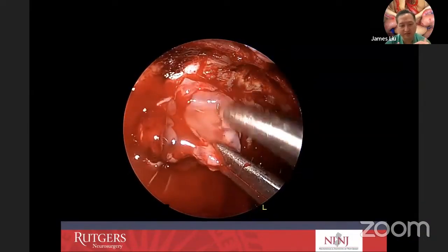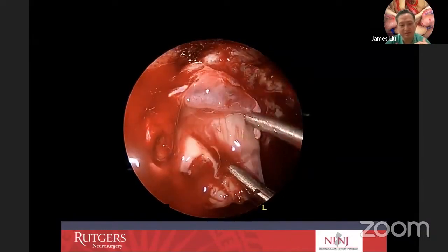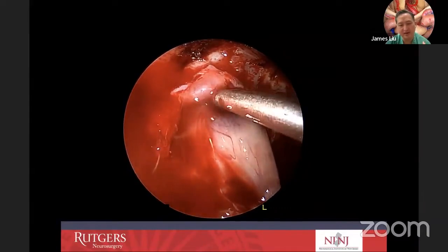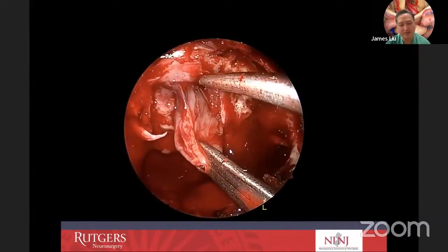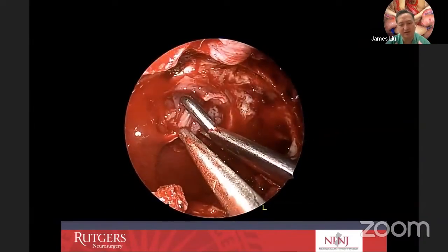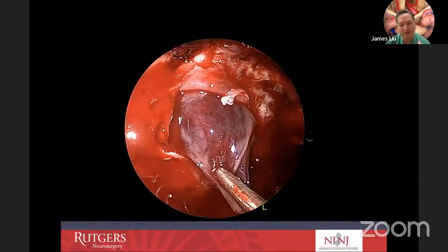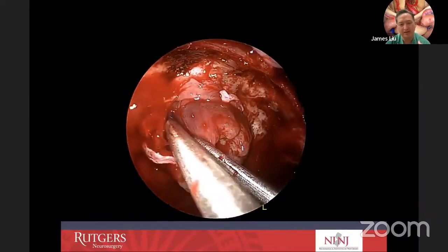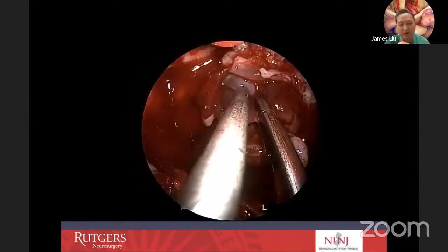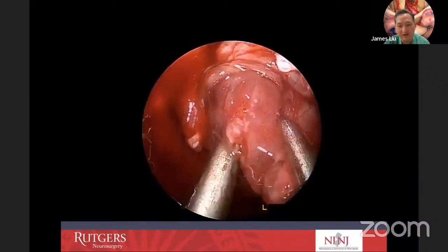So here we're doing extracapsular removal. What I'm doing is putting a little gentle traction on the tumor pseudocapsule and then using the suction to dissect away the cisternal barrier. You can see there's a little bit of seepage of CSF, but not terrible. I'm still relying on the pulsations of the CSF to push the tumor out, but I'm going to use a little gentle traction. And then with the suction, we'll use suction dissection to sweep the arachnoid barrier away from the pseudocapsule. So you can see I'm looking for that interface right there.